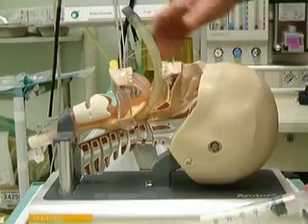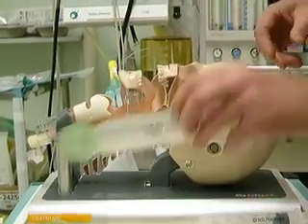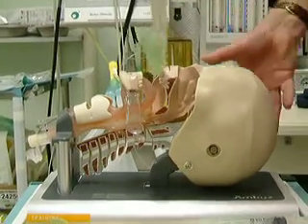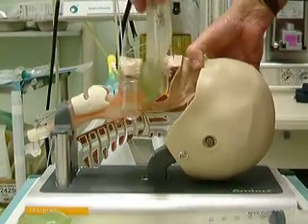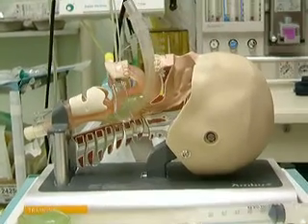If I put an iGel airway in — I am going to choose a size 4 — it also sits periglottically.